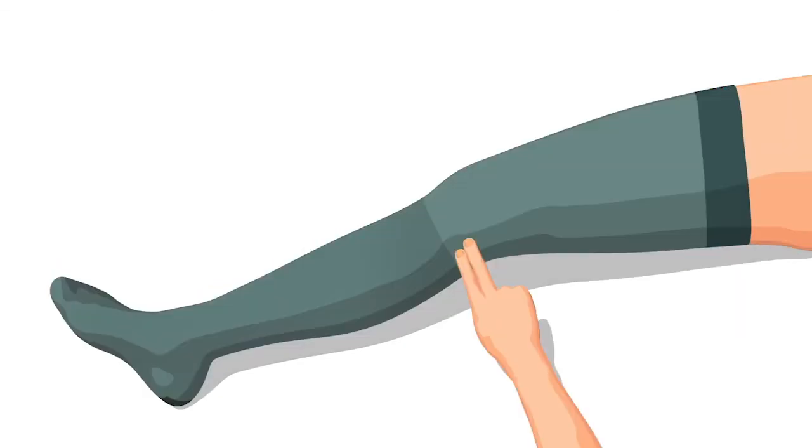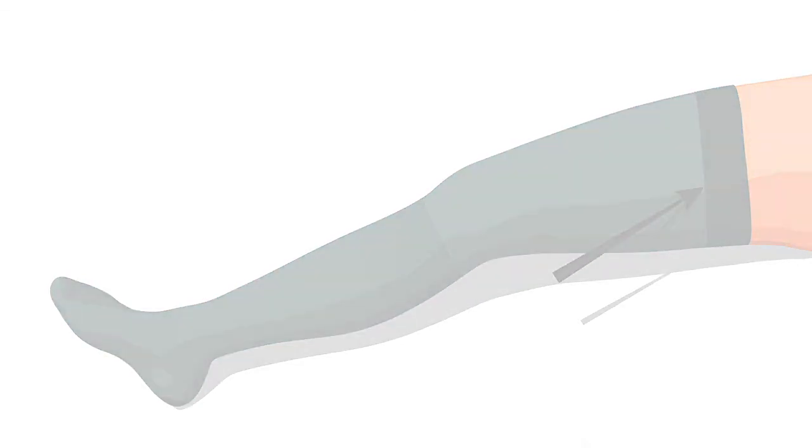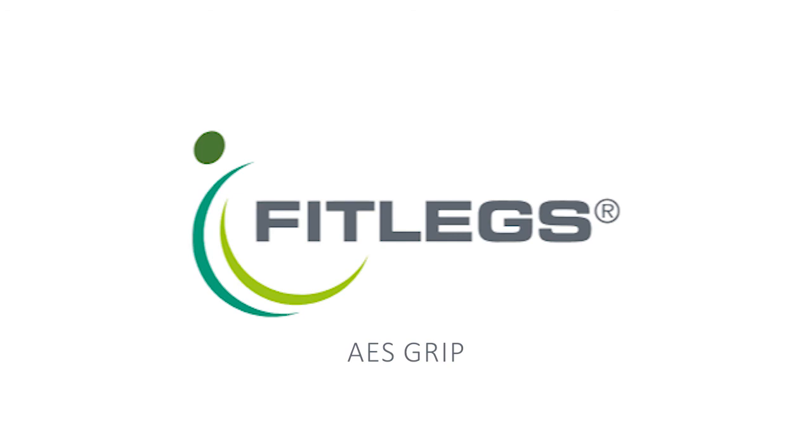The FITLEGS thigh-length stocking has a band where a change in the weave can clearly be seen. This should sit 2 finger widths below the back of the knee. The non-slip band at the top of the stocking should rest in the upper thigh area.